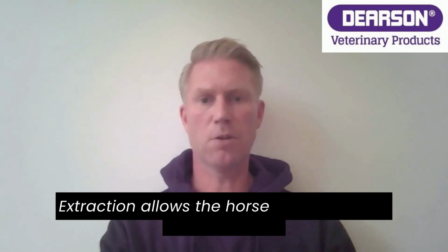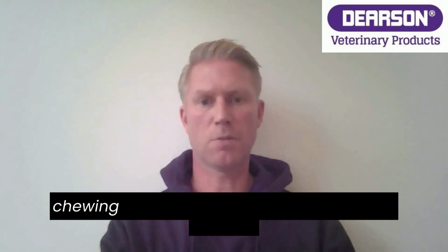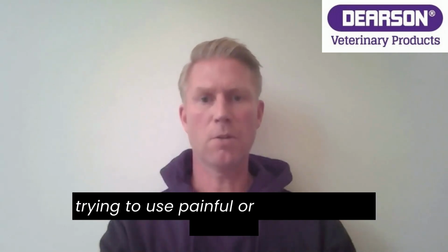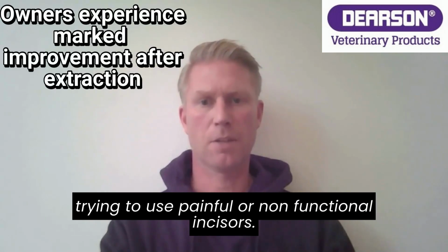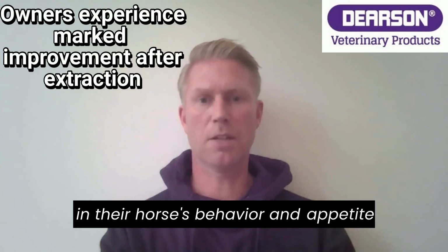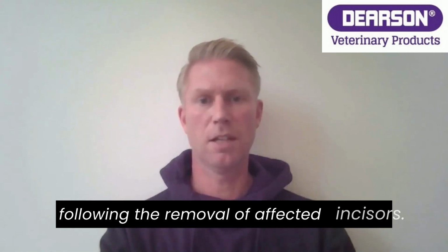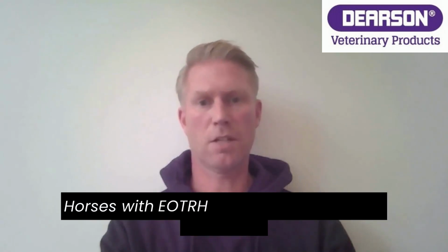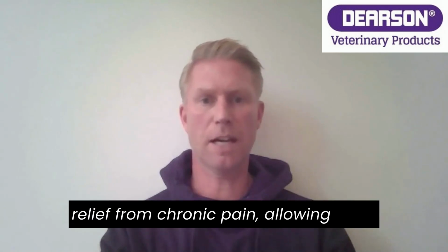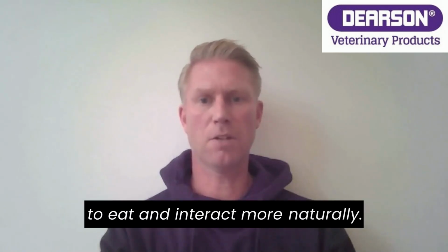Extraction allows the horse to adapt more comfortably to chewing with other teeth and alleviates the strain of trying to use painful or non-functional incisors. Owners often notice a marked improvement in their horse's behavior and appetite following the removal of affected incisors. Horses with EOTRH frequently experience significant relief from chronic pain, allowing them to eat and interact more naturally.